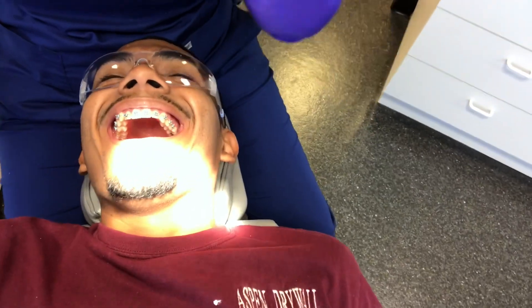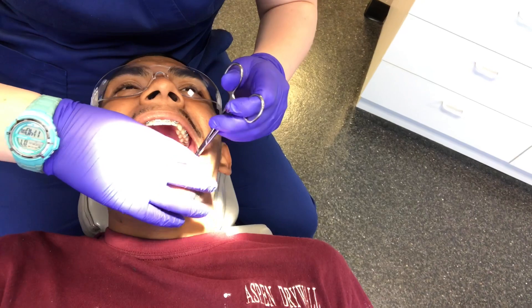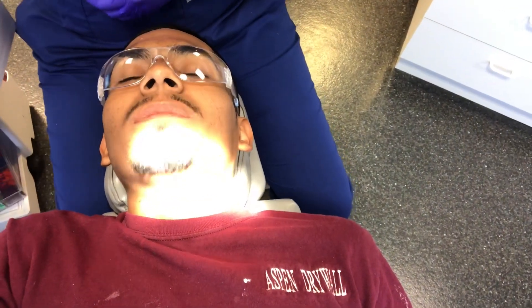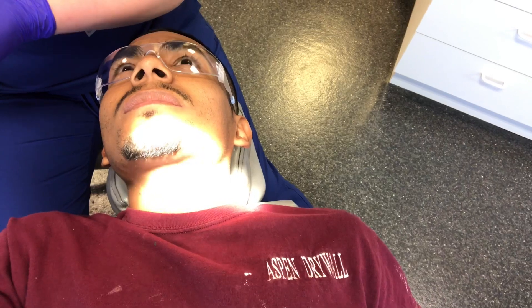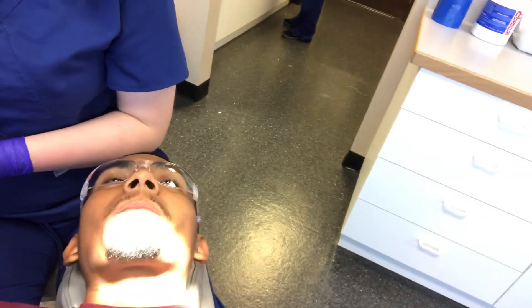I'm going to take out that little piece of rubber. You have very tight connections on that one. But we'll use the metal one — don't let it scare you. Is it like the same size and everything? It's the same size but a little different. Instead of a full circle, it's like a little C shape. It's actually a lot easier to put in. Is it the same amount of pain? You're going to feel that pressure again, but nothing crazy like I just did.